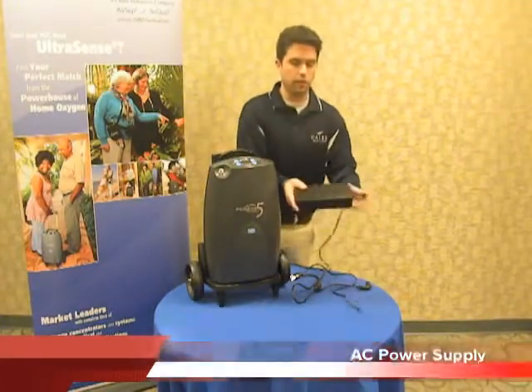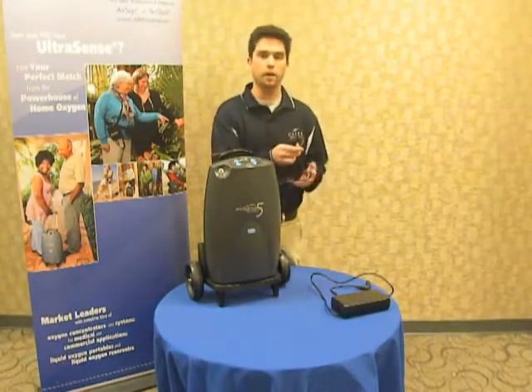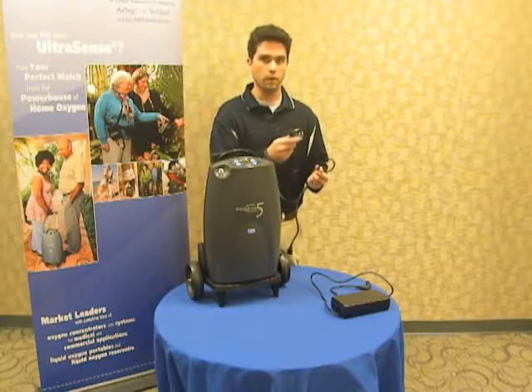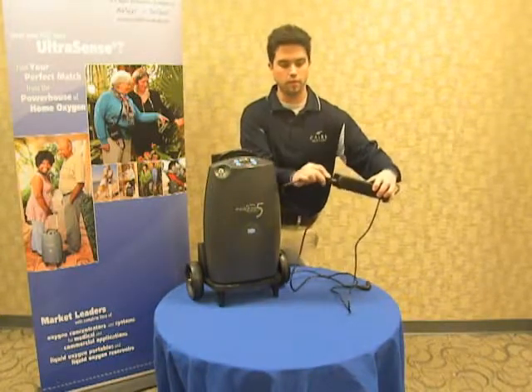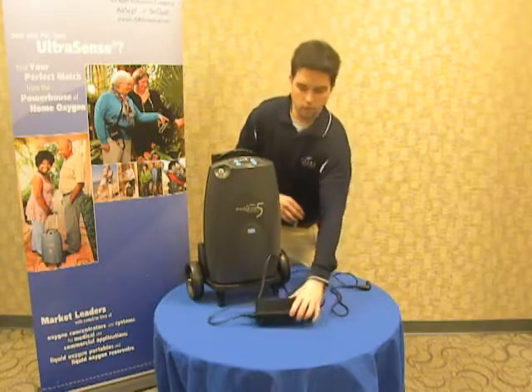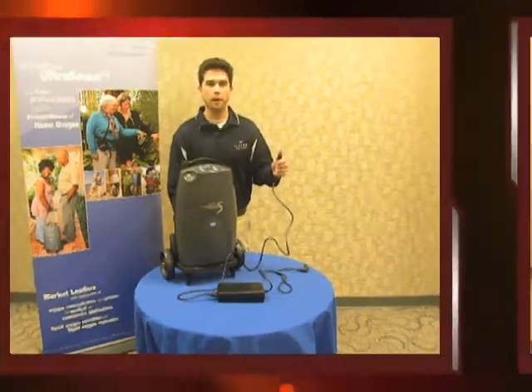Your AC power supply is this brick here, and a combination of the cord that you also got in the original packout. Before you can start using it, you'll need to install the cord into the power supply. It's a three-prong connection here on the side that you'll simply insert straight in and push to make a secure connection. Once you've done that, you can go ahead and plug into AC power.